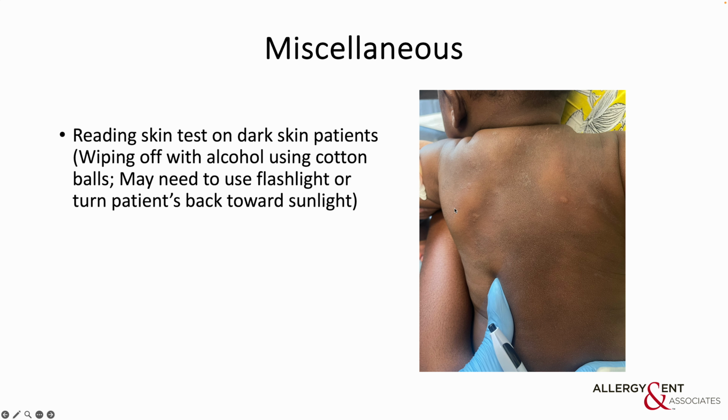Okay. So there are several caveats about the skin testing I want to talk about. So reading skin tests on the dark skin patient can be very tricky. I was told by the staff sometimes you can wipe off using the alcohol pad or using a cotton ball. It may help showing the redness, okay? But for the dark skin patient, you really rely on the wheal. And then you compare with the positive control.